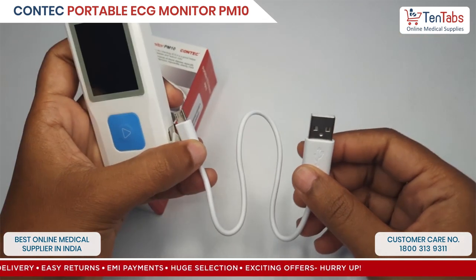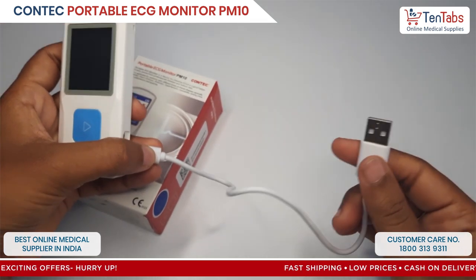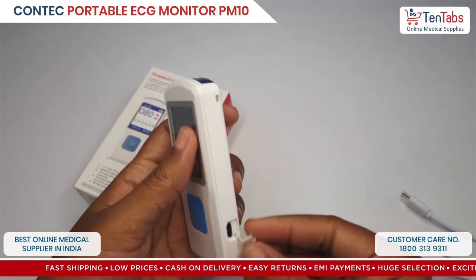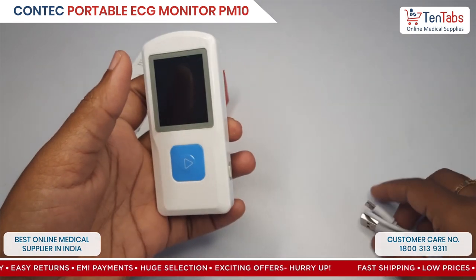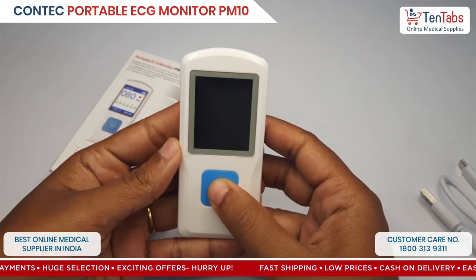You need to connect this to the PC, or you can connect it to a power adapter. Once the device is charged, you can use it for around 3 to 4 hours and it will give you a continuous sampling of 300 ECGs. Now let's turn on the machine.